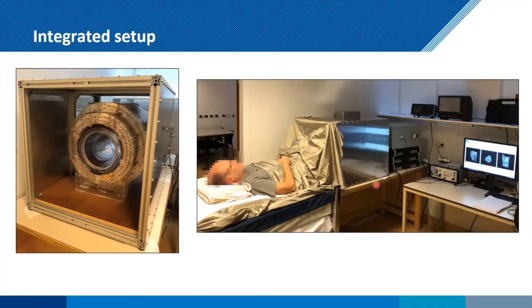We're not in a shielded room, I think, unlike Clarissa's setup. And so we have built just an aluminum frame around here. And in order to sort of simulate that shield, we have a conductive cloth that goes over the body here and just connects over here to the shield.